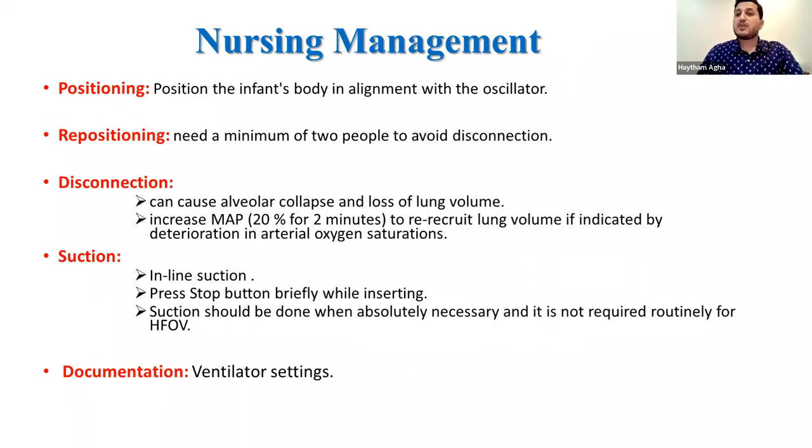Nursing management is all about position and reposition. It's better to put the high frequency ventilator at the head of the infant, so if you are turning the patient to the right or to the left side, you avoid disconnection of the tube. If there is a disconnection, you can increase the mean airway pressure by 20% for 2 minutes to re-recruit the lung again. Regarding suction, we are using inline suction, and suction during high frequency should be minimized, done only if wiggling decreases or if you find the patient is desaturating.